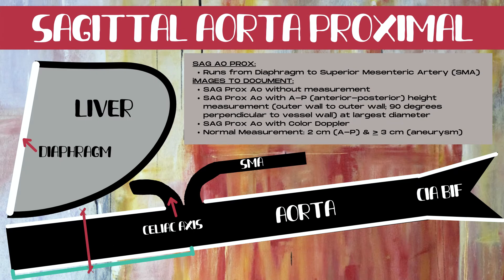For our aorta protocol, we're starting in the sagittal aorta in the proximal segment, which runs from the diaphragm to the superior mesenteric artery, or SMA. Document a sagittal proximal aorta without measurement, a sagittal proximal aorta with an AP or height measurement — outer wall to outer wall, 90 degrees perpendicular, at the largest diameter — and a sagittal proximal aorta with color Doppler. A normal measurement is two centimeters AP; greater than or equal to three centimeters is an aneurysm. Most importantly, carefully sweep medially to laterally through the sagittal proximal aorta to look for any dissections or pathology before collecting images.